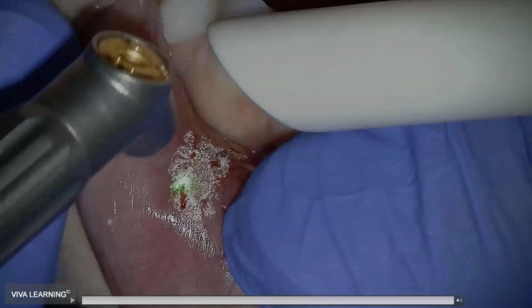So the most it's going to do is this, maybe, to tissue if you even see it, especially if the water's going. You have to actually intentionally hold it. Like if I'm going to do a frenectomy, I have to hold it there. And if I move my hand too fast, it doesn't allow the laser energy to gather up and it doesn't cut. And so that's the benefit of using this laser.